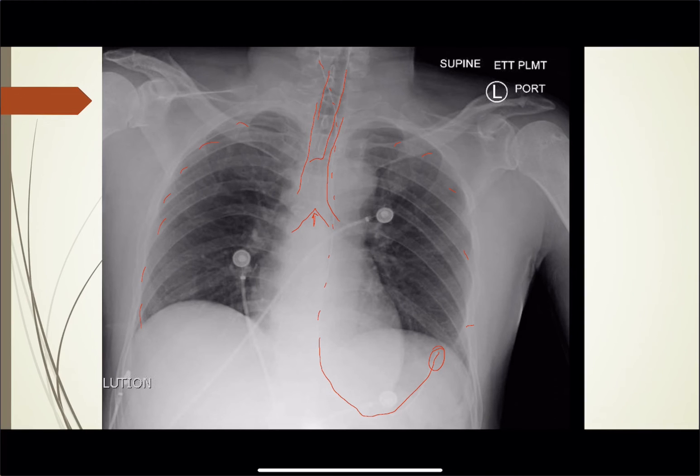The NG tube is also in an appropriate position, so it looks good. Again, if you could not see that carina — this one you can, which is nice — you can count the thoracic vertebrae down: T1, T2, T3, T4, T5 — so it's about the T6 level.